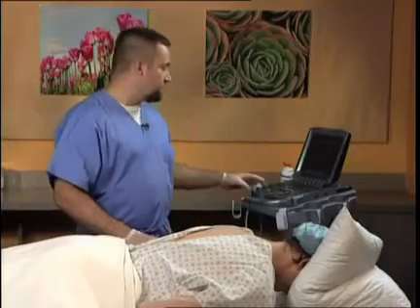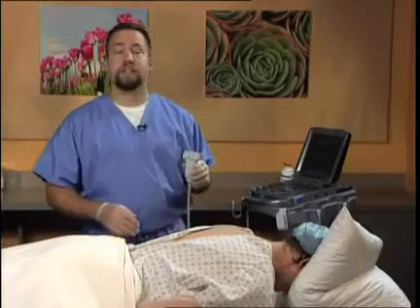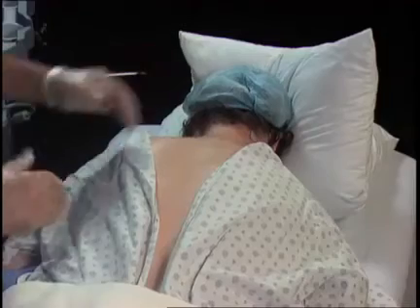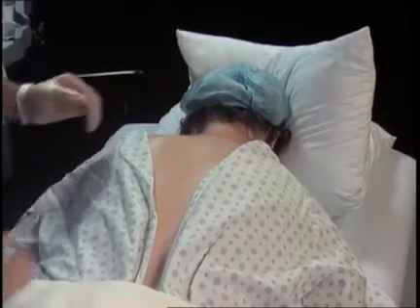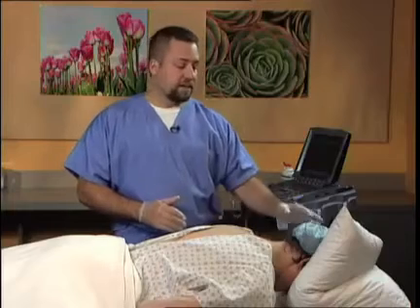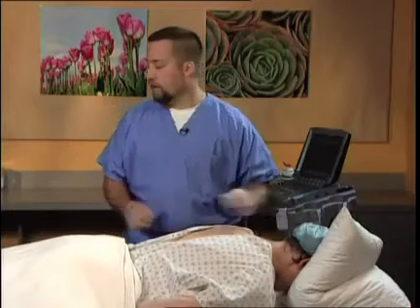Utilized in this particular block will be the mTurbo ultrasound system, utilizing the high frequency HFL 50 linear probe. The patient is placed in the prone position, a bolster is placed under the thorax, the head is slightly flexed, and then the hair moved out of the way.